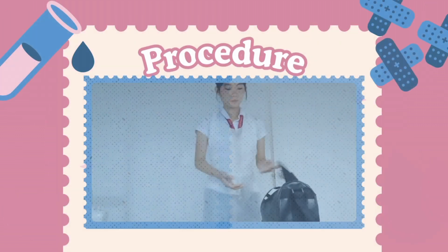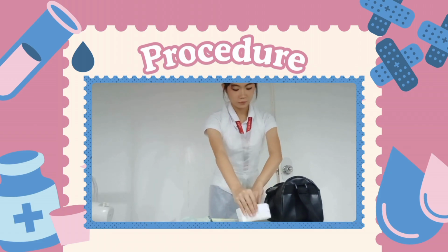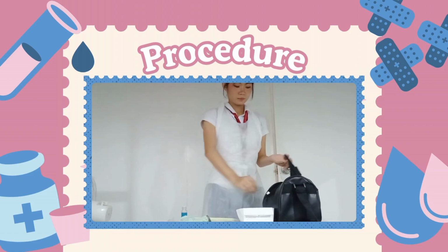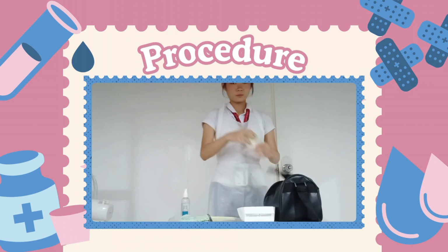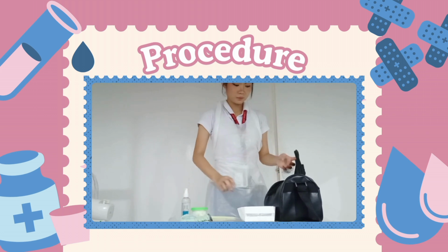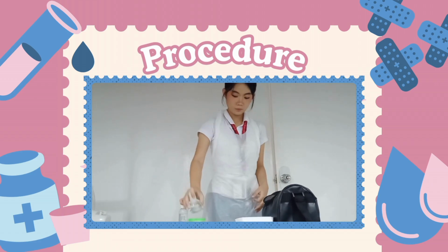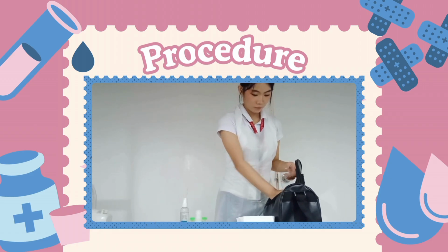I will now select only the essential supplies for the procedure, thereby maintaining order and reducing the likelihood of exposure to contaminants, such as the waste receptacle, the Benedict's solution, the alcohol, cotton balls with isopropyl alcohol, test tube holder, alcohol lamp with alcohol, and lastly the test tube.